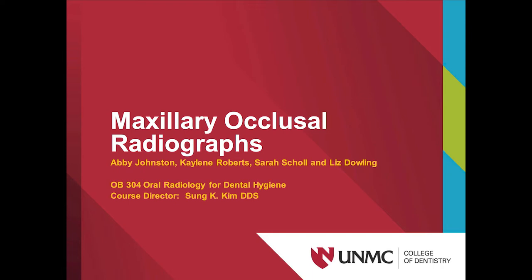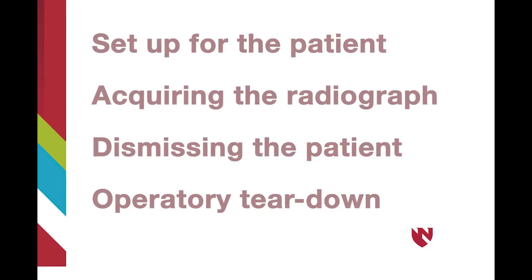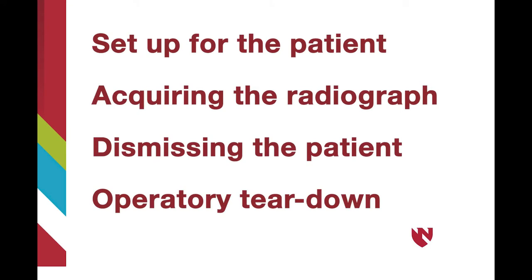The goal of this video is to demonstrate how to complete a maxillary topographic occlusal radiograph on both adult and pediatric patients. This will include how to properly set up for the patient, demonstrate how to acquire the radiograph, and how to dismiss the patient and tear down the operatory.